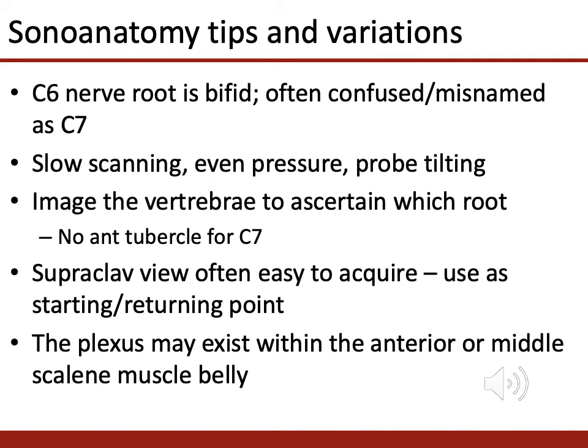Like we've already said, imaging the vertebra allows us to ascertain which nerve root we are indeed looking at. And if we lose our way, then we return to the common place with less anatomical variation, which is the supraclavicular view. It's often easy to acquire, and, like I said, it is a good starting or returning point.